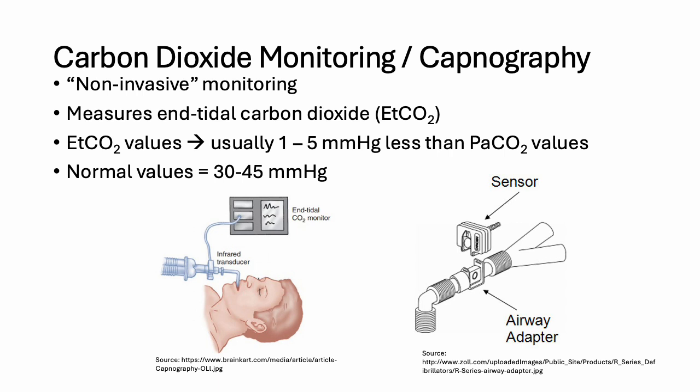Okay, so there are two ways of doing it. Number one is always within the mechanical ventilator circuit. Okay, and this can be an electric sensor that immediately senses the CO2 and then transmits it, and then you see the graph as well as a number on the screen. There are also EtCO2 sensors where it actually extracts the exhaled breath, and then does a moment by moment actual CO2 analysis.